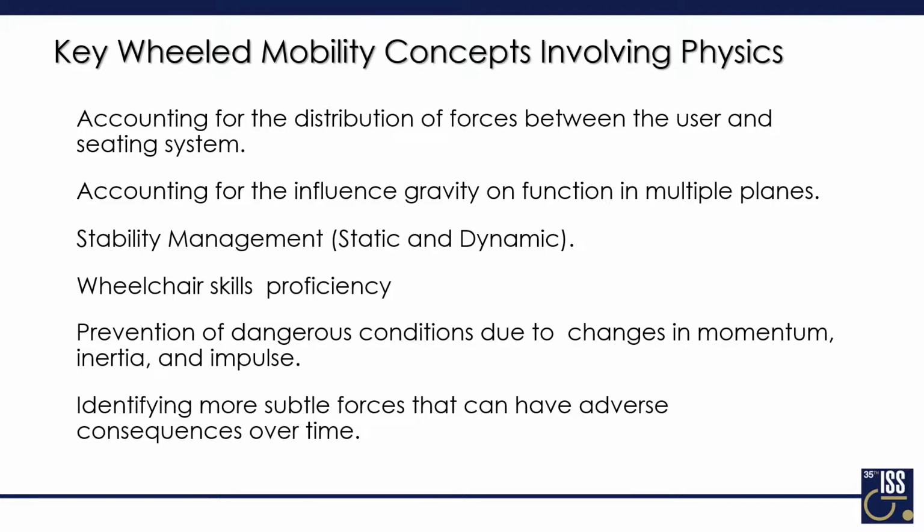And also just identifying those more subtle forces that are always at play and are going to cause longer term problems. I mean, how many chairs have center mount foot plates these days that don't have any inversion or eversion adjustability? And if they're on a mid-wheel drive model, a lot of times we're positioning at least adult males with their legs kind of tapered inward. And if they're in that position for a long period of time, are those forces going to start to have an effect? And as clinicians, we need to think about that for the long term. It might be okay in the short term, but when we identify problems like that, we need to also have an open dialogue with manufacturers and suppliers.